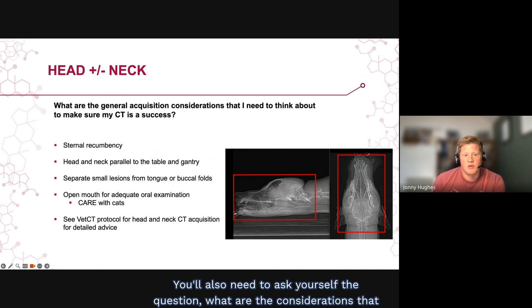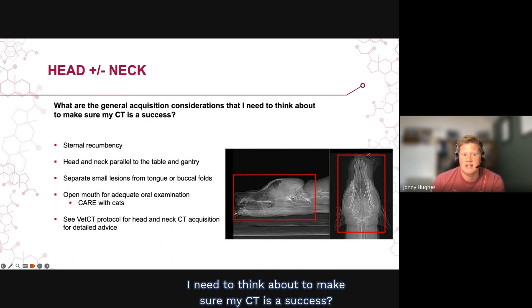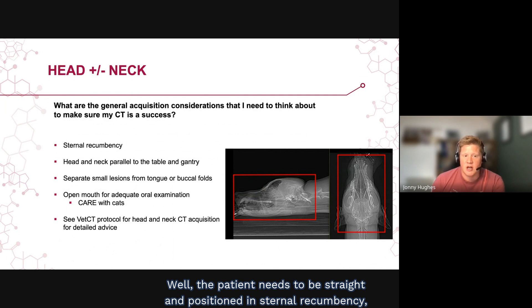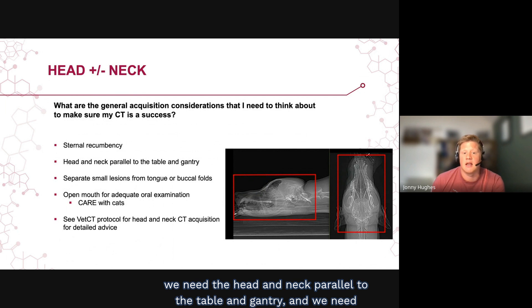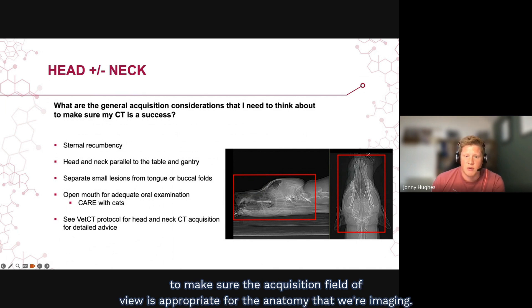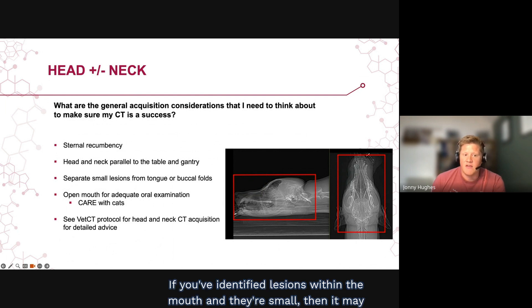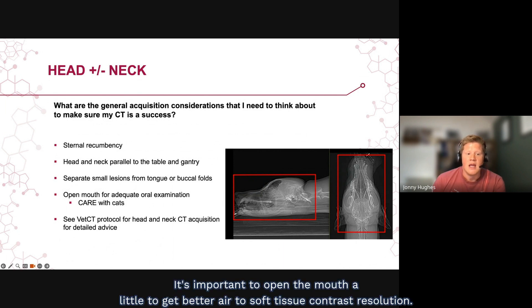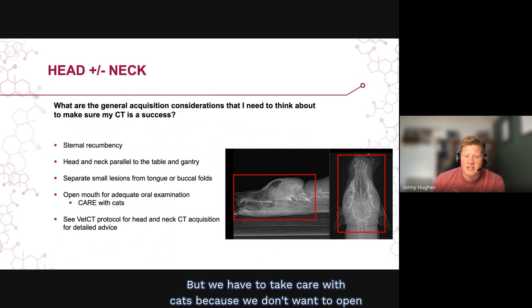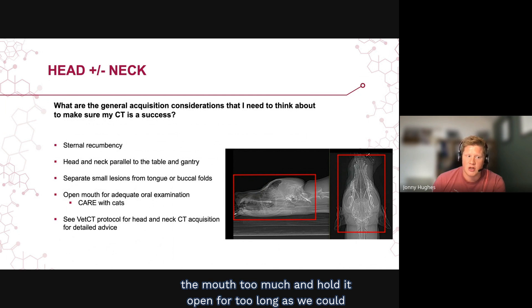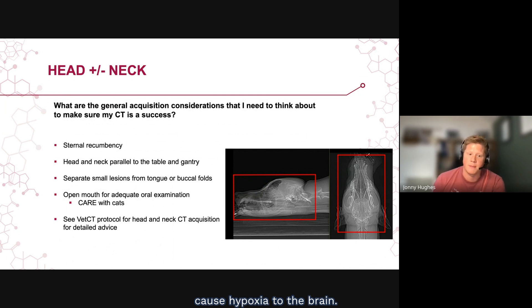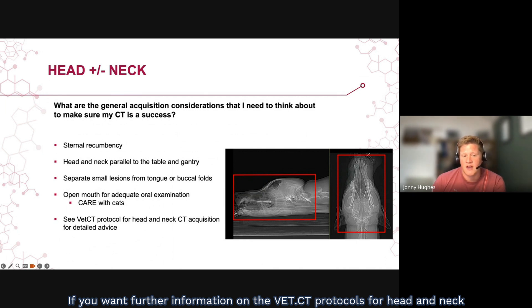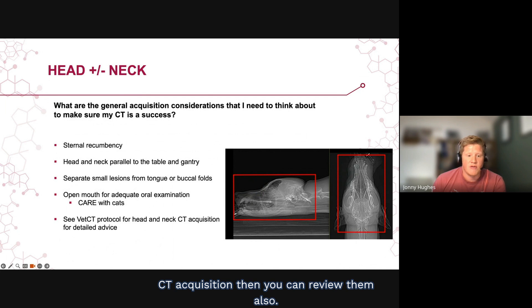You also need to consider what's required to make your CT a success. The patient needs to be straight and positioned in sternal recumbency, with the head and neck parallel to the table and gantry, and the acquisition field of view appropriate for the anatomy being imaged. For small lesions within the mouth, it may be necessary to separate them from the tongue or buccal folds for better visualisation. It's important to open the mouth slightly to get better air-to-soft-tissue contrast resolution, but take care with cats not to open it too much or for too long, as this could cause hypoxia.